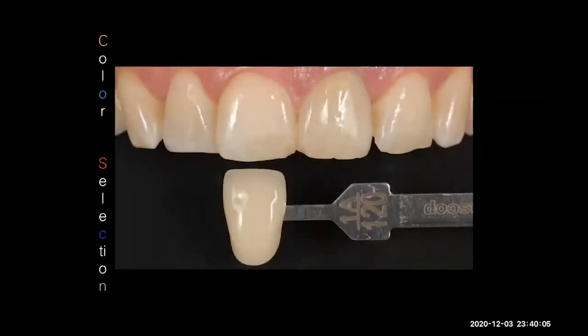And look at that. He took the picture before he removed the temporary. So this is the right moment to take the color. Not once you remove the temporary, because once you remove it, the patient has at least 5 to 10 minutes with his mouth open and the teeth get dry. So you need to do it in that moment.